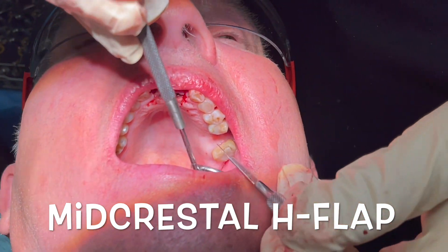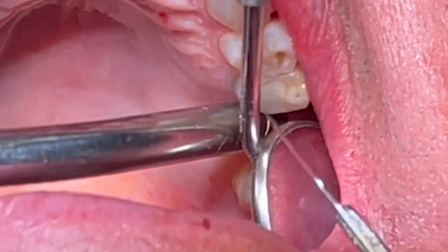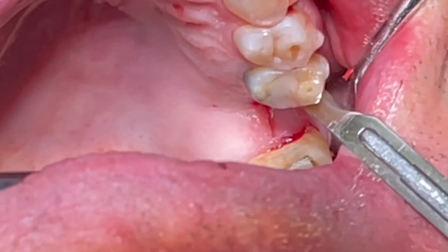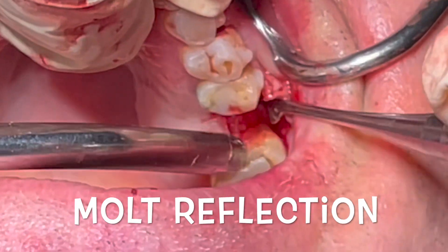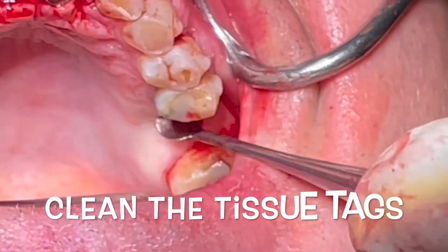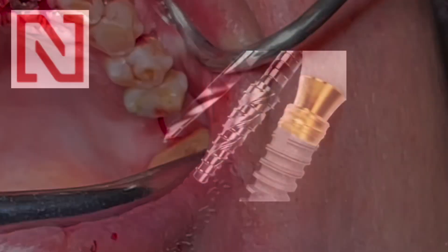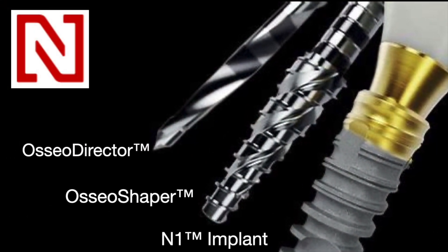We've also placed a couple of implants in the anterior — we're ignoring that right now, but those have been placed a little bit earlier in the same day. We'll do an H flap and raise this so that we can get a good look at the bone. We're doing an incision mid-crestal so that we can come back and close this around the healing abutment. We want to make sure all the tissue tags are cleaned out and that this area is going to be nice and well designed for the implant to have success.